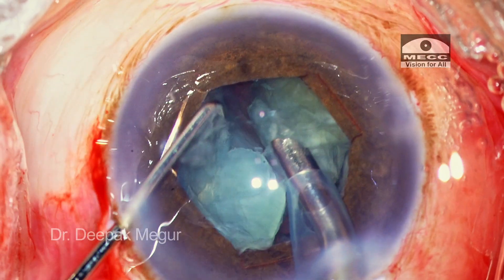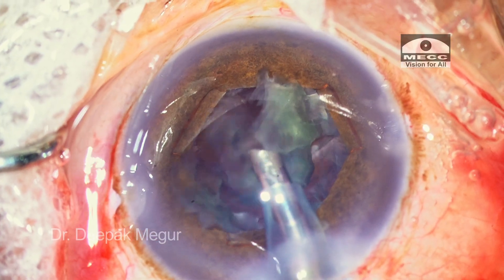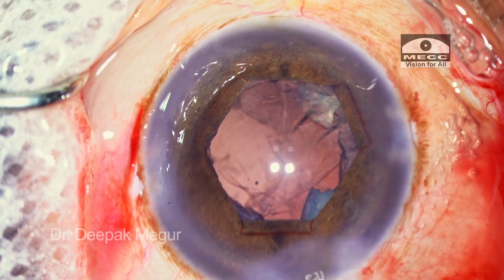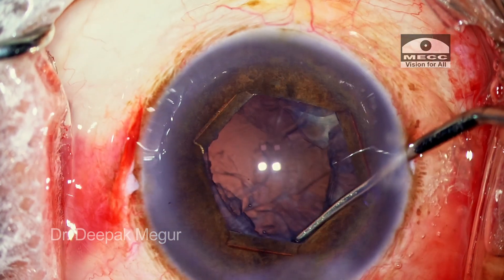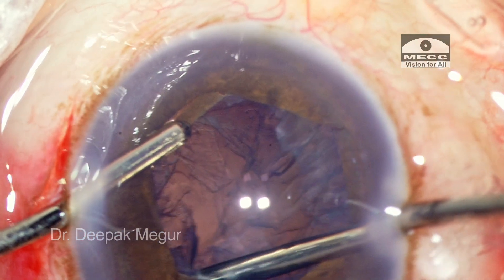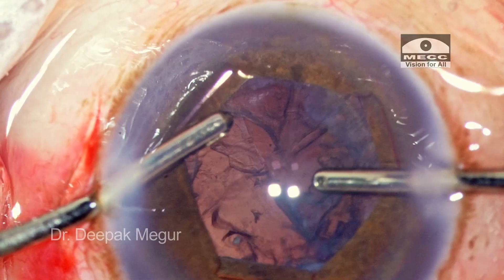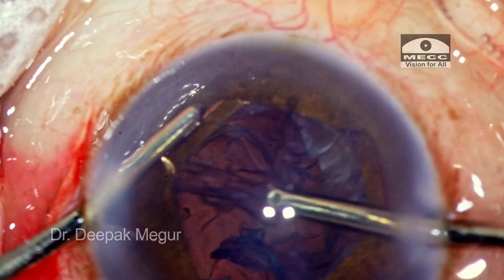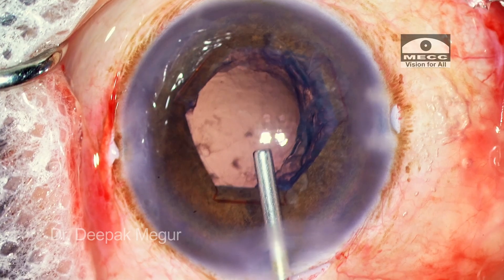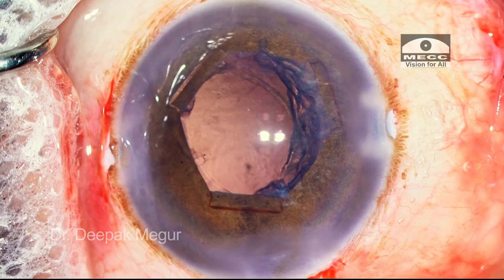As she's about to deal with the second heminucleus, she notices an increase in positive pressure and literally sees that the posterior capsule has come anteriorly. She asks the patient to breathe easily, take deep breaths, just to relax him. The second piece is eventually chopped into smaller fragments and aspirated, but one fragment goes hiding behind the iris. She's now in a dilemma whether to take care of the small piece or deal with the cortex first — she decides to deal with the nuclear fragment later and proceed to cortical aspiration. As she begins, she again notices the posterior capsule is bulging out, pushes OVD to push it back, talks to the patient, reassures, and waits for the patient to recuperate.